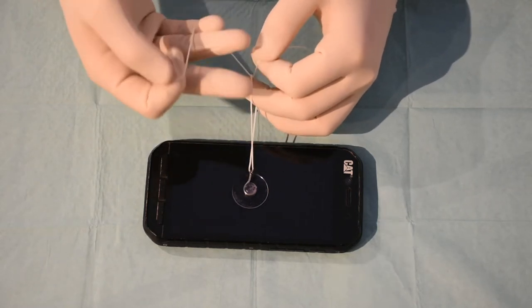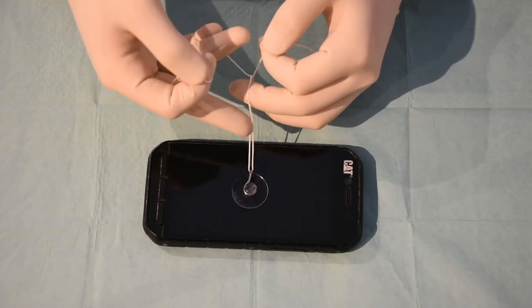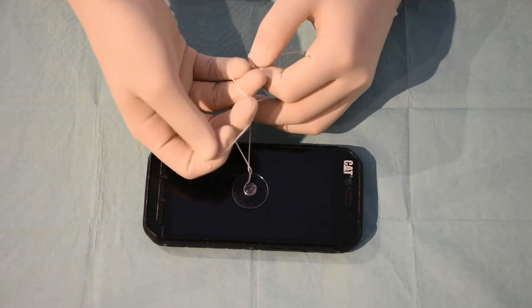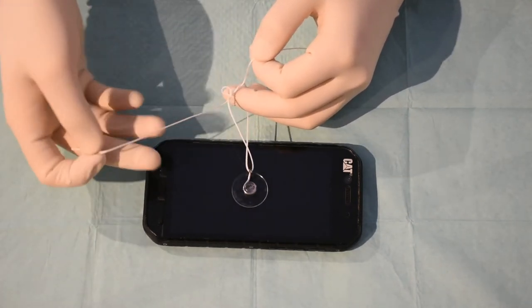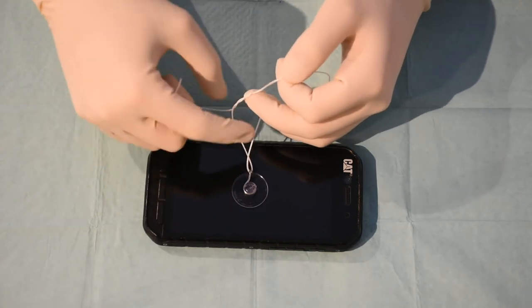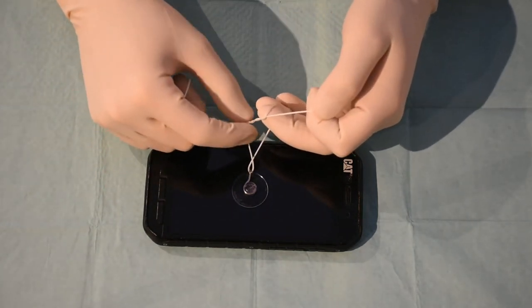With your other hand you do another karate chop. Instead of using the thread, you're going to use a loop to go around like this and pull it through again. This will end up being a surgeon's knot because it's a double wrap over here.